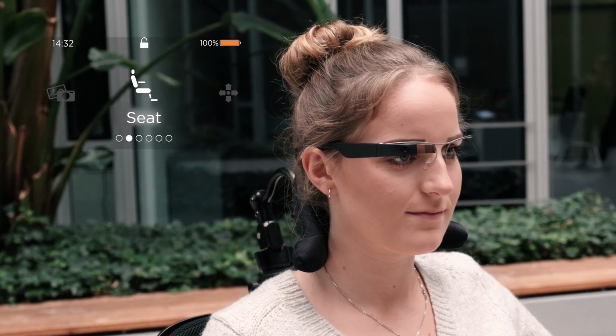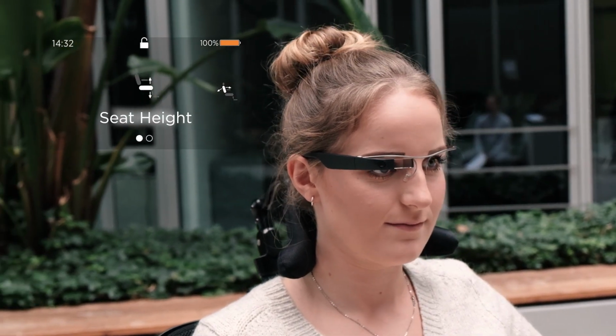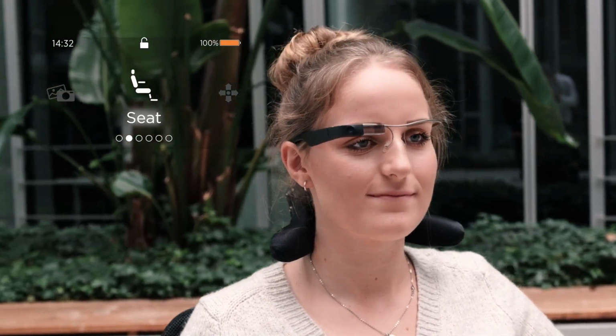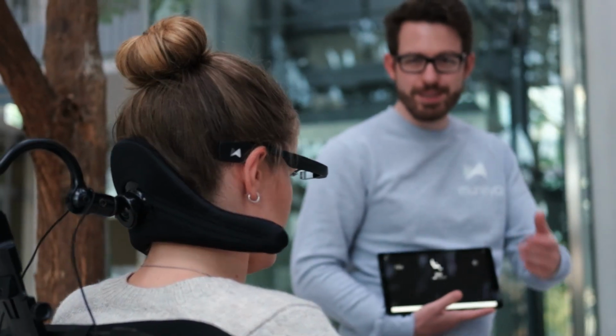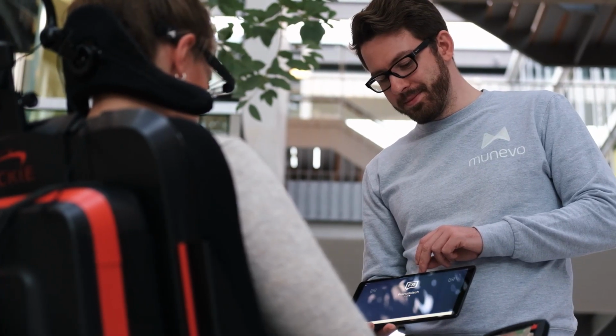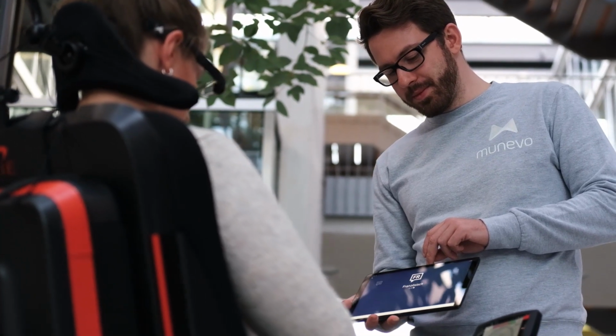By nodding down, you select a point. By nodding upwards, you go back one step. In addition to various functions such as seat adjustment, you can also take pictures with the glasses, change the volume, adjust different languages, and much more.